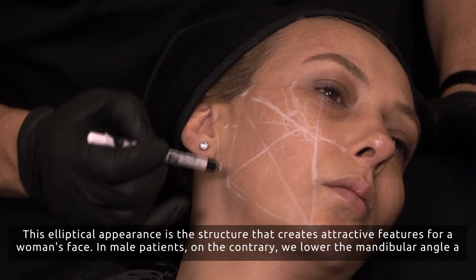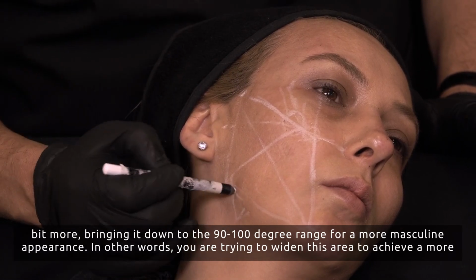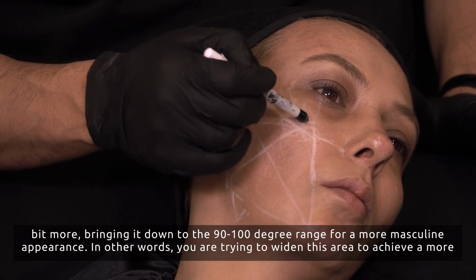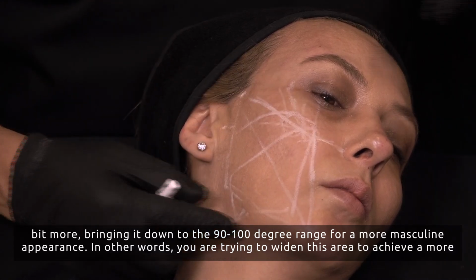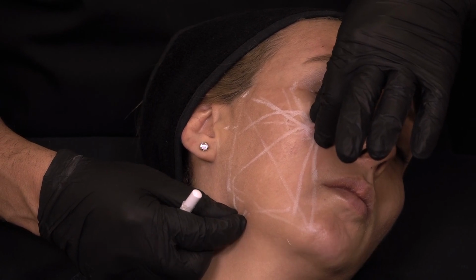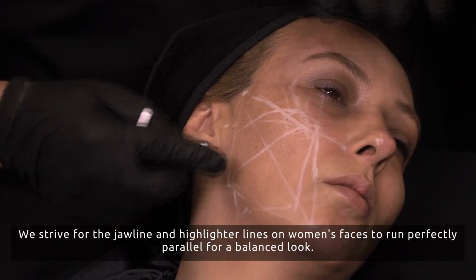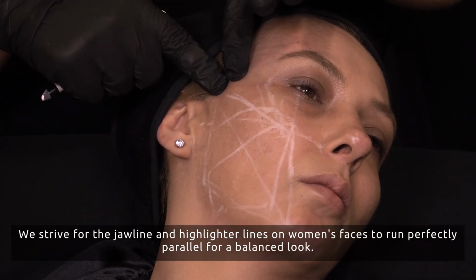In male patients, on the contrary, we lower the mandibular angle a bit more, bringing it down to the 90-100 degree range for a more masculine appearance. In other words, you are trying to widen this area to achieve a more masculine look, aiming for a broader and thicker jaw. We strive for the jawline and highlighter lines on women's faces to run perfectly parallel for a balanced look.